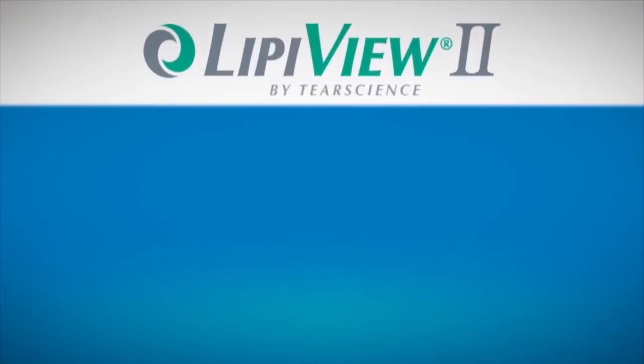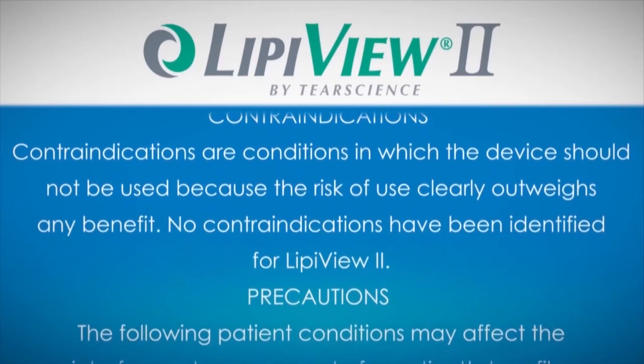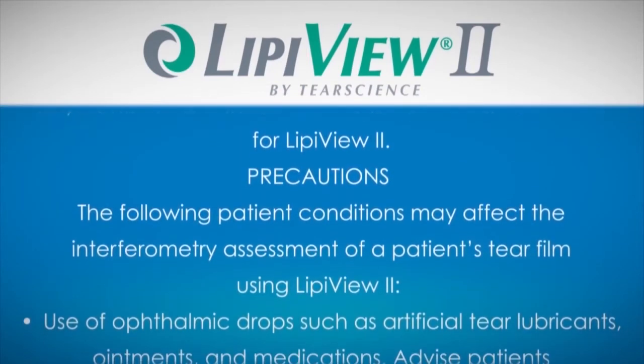The following is important labeling information for LipiView 2. This information is also provided in the LipiView 2 Ocular Surface Interferometer instructions for use.